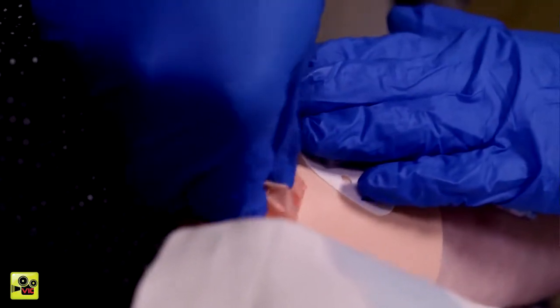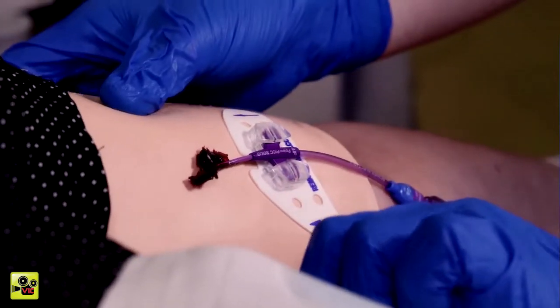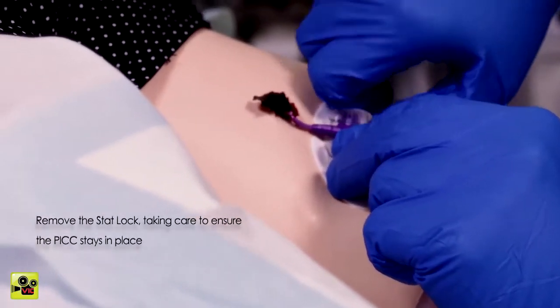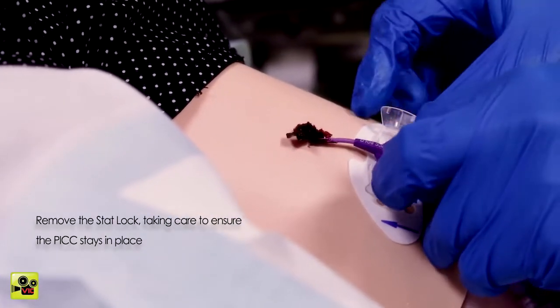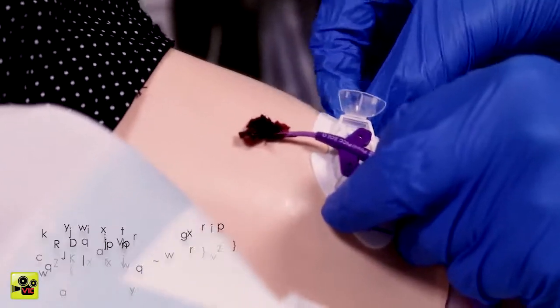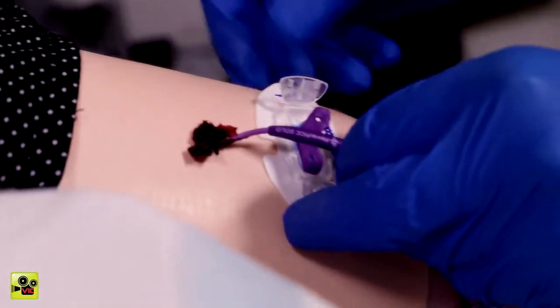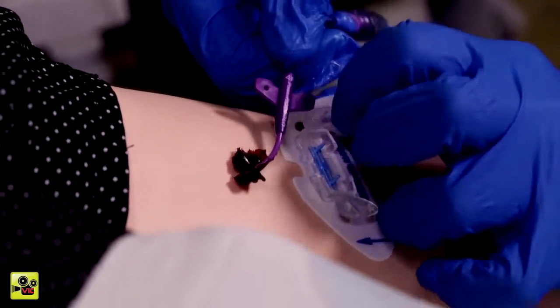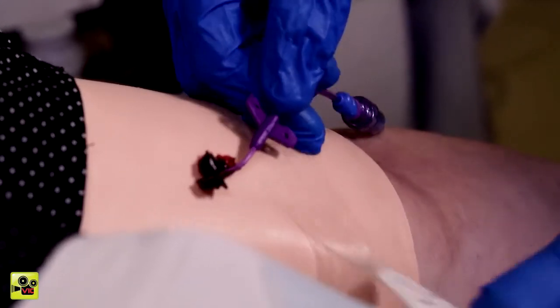A little bit of dried blood here, there we go. I'm just removing the stat lock now. You might feel a little bit of a pinch. Sorry. Yeah, that's okay. It's very sticky. You're doing a great job, Jane.